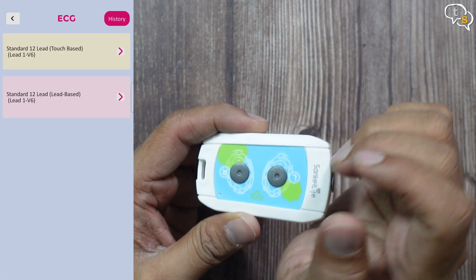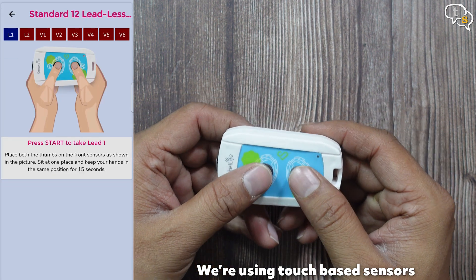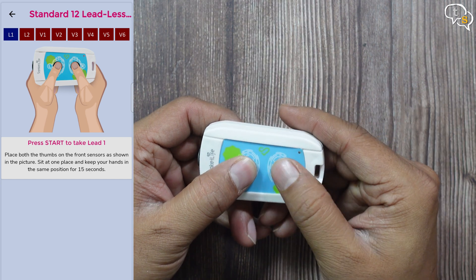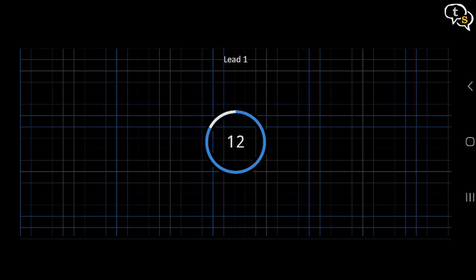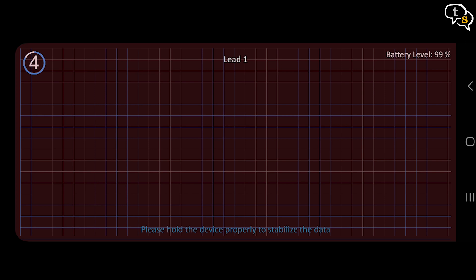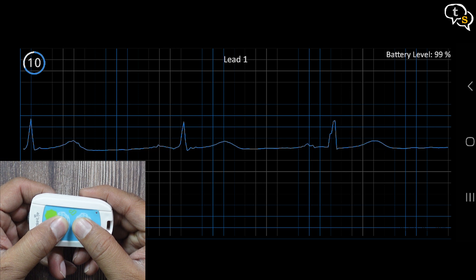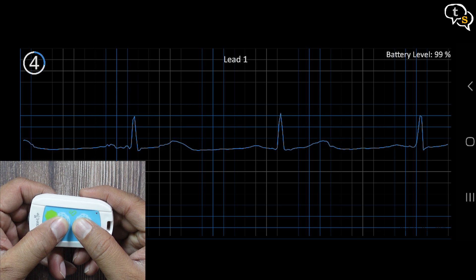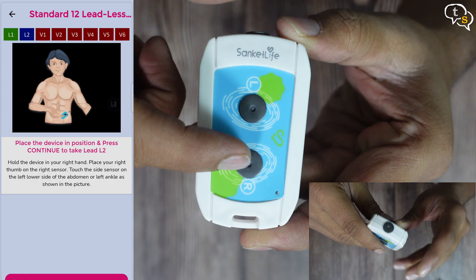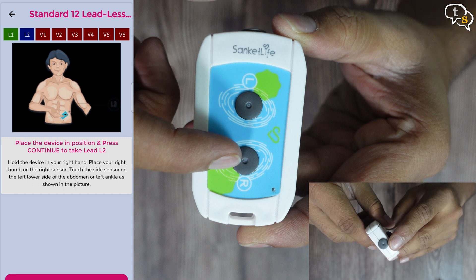Now for the ECG. Tap on ECG button on screen. Standard 12-lead touch based readings. First reading is taken by placing your thumbs on the left and right sensor, also called L1. And here we go, this is how the reading looks in real time. We have the device battery level displayed on the top right and below we have the heartbeat waveform. The red light on the device also pulsates when a reading is being taken. Second reading is taken by holding your right thumb on the R sensor and touching the side sensor to either your abdomen or left ankle. This is L2.